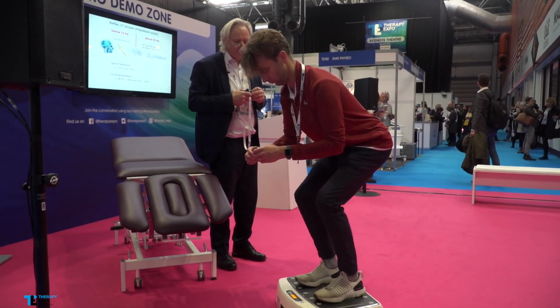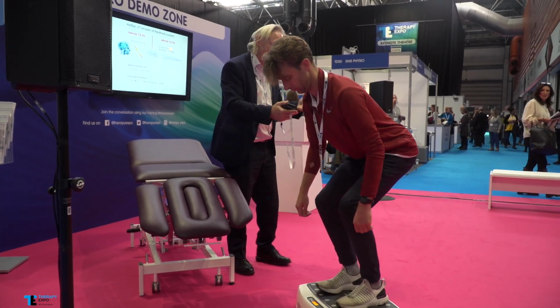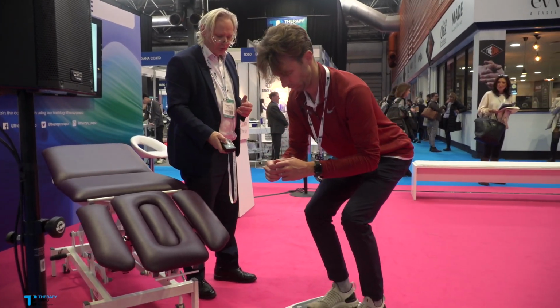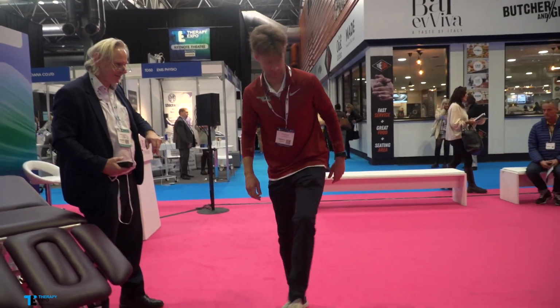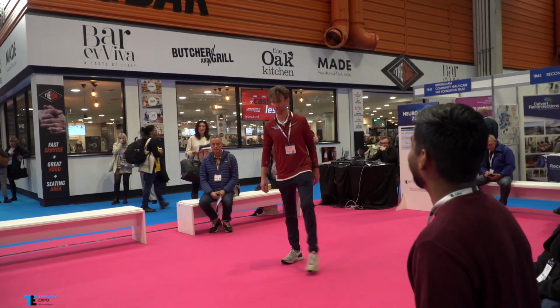So 15 seconds, and then I stop it. And what happens due to the high muscle tone, the blood circulation in the muscle is reduced, and then the muscle gets more and more tired. So I will stop it now. And now walk, and you are like new. How do you feel? Very light. Very light, yes, very light.